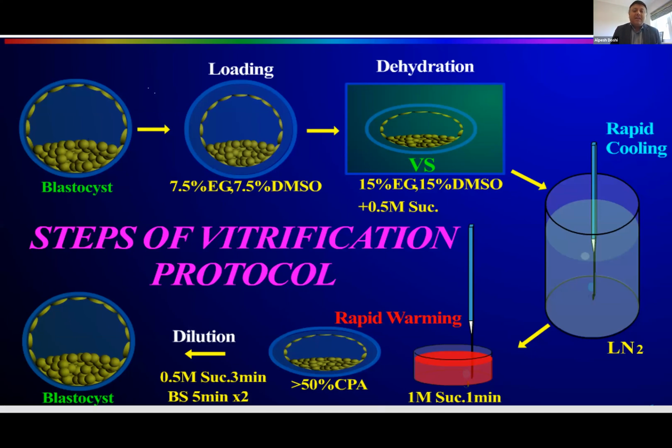When you're warming the embryo, the warming rate is extremely important, and we'll be speaking a bit more about that. So one thing to understand from the physics or biophysics perspective is that when you're vitrifying, you're removing all the water from the embryos by dehydrating it.